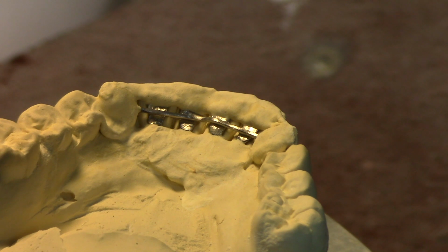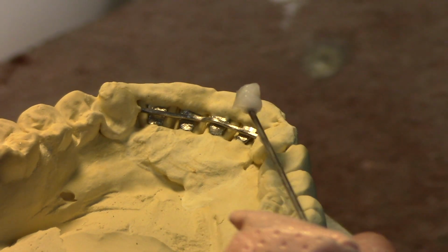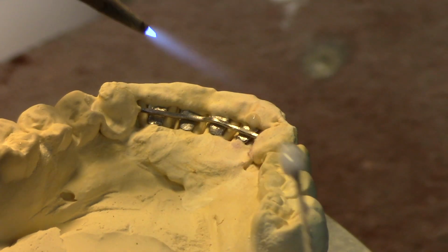I'm going to adjust my oxygen a little bit. Okay. Now I can kind of keep the heat confined to each individual area. I'm going to turn on my exhaust fan here, try to keep the fumes out of my face while I do this. And I've got a little flux on here. I'm going to transfer it. We'll start over here first.